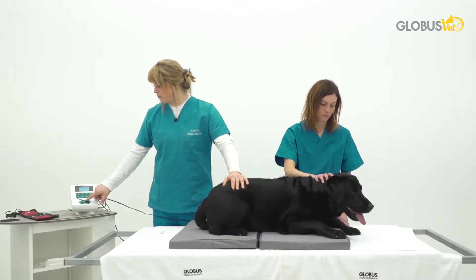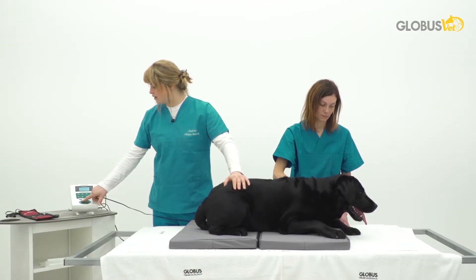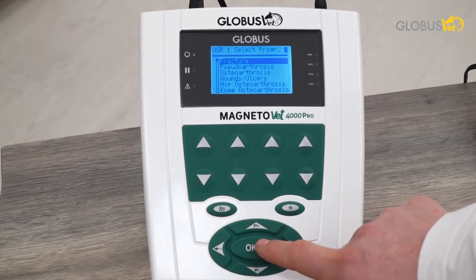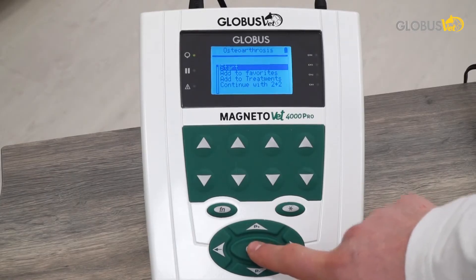Let's go over the program list of our MagnetoVet 4000 Pro. We have a dog — a case of osteoarthritis of the hip in a Labrador — so we'll select osteoarthritis and then simply push start.